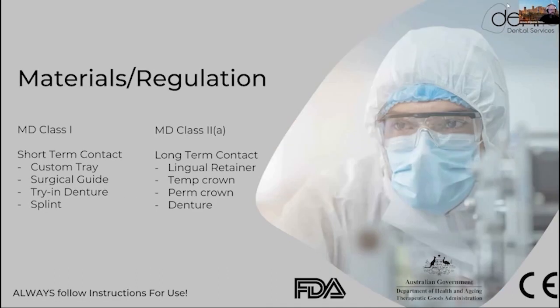I want to talk a little bit about materials and regulations. So the golden rule I always hand, and there is always a discussion point, but I say if it's a short-term contact, I would like to classify it as a class 1. So a custom tray, surgical guide, try-in denture, or a splint. If it's anything that is long-term inside the mouth, like a lingual retainer, a temporary crown, permanent crown, a denture, an RPD removable, whatever stays longer inside the mouth, classified as a class 2 or class 2A.